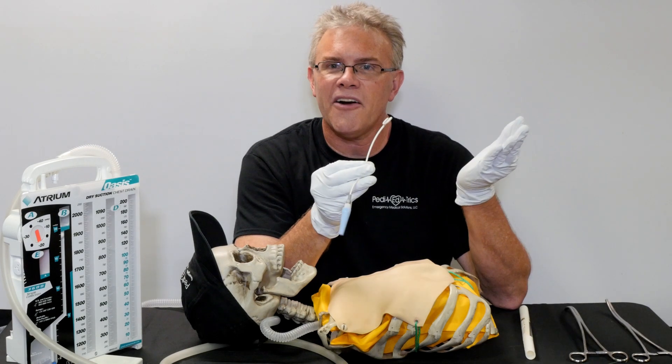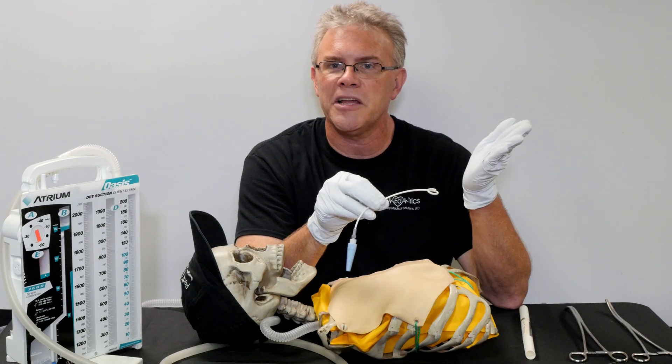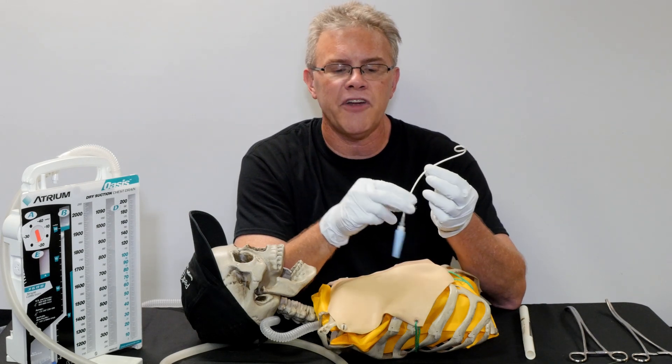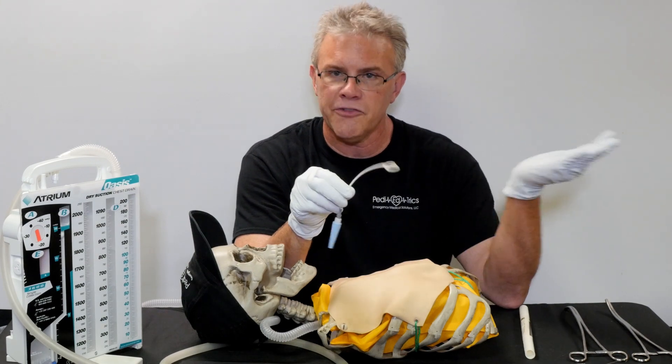So whether it's for babies or for big people, it used to be just for medical cases, but now places are placing pigtails for trauma as well. Pigtails of various sizes is something you're probably going to see far more of in the future.